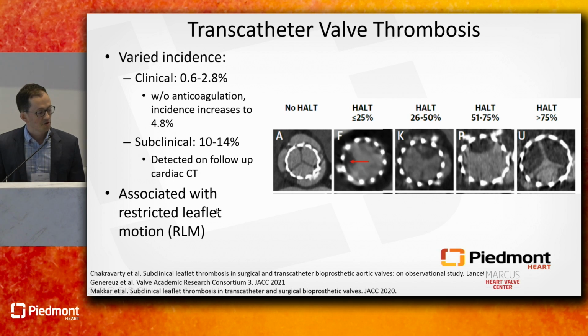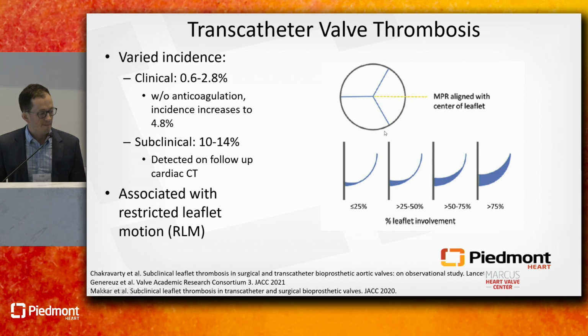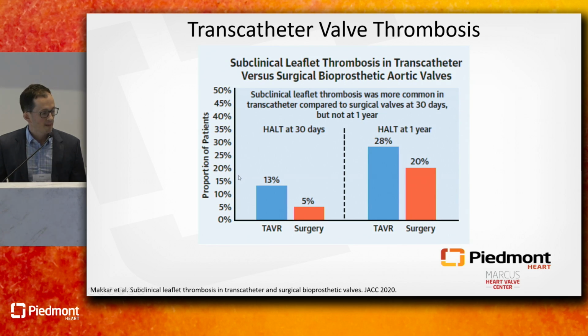And the HALT is associated with what we call restricted leaflet motion, or RLM, and that's what's going to lead to the hemodynamic changes. And again, this is just a kind of cartoon showing the degree or severity of HALT based on the amount of leaflet involvement. This study was from 2020, and it looked at subclinical leaflet thrombosis in TAVR and surgical valves.